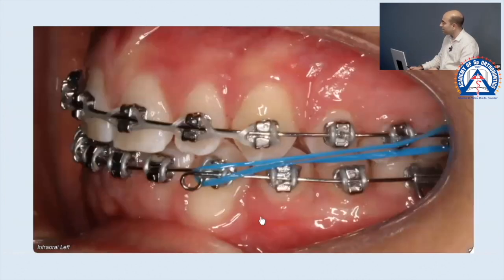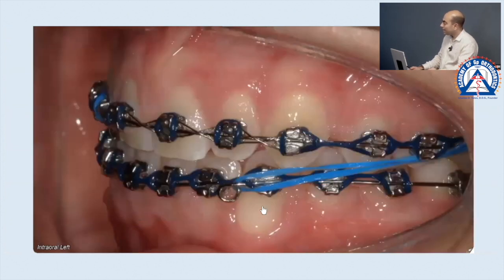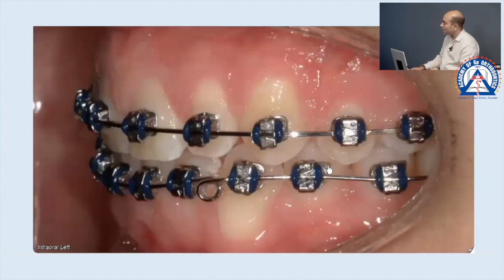Now we'll go on the other side. Let's see what happened. We stopped at the 3. So now we have some space. Okay? So now we're trying to bring the posteriors forward, but see how we have the canine still tied all the way through? So in theory, we shouldn't open the space. But now we're using the midline elastics and the power chain to close that space. Let's see what we did. That was in July, August, boom.